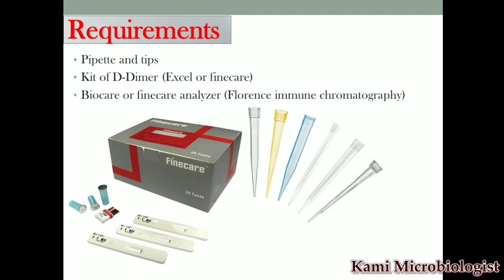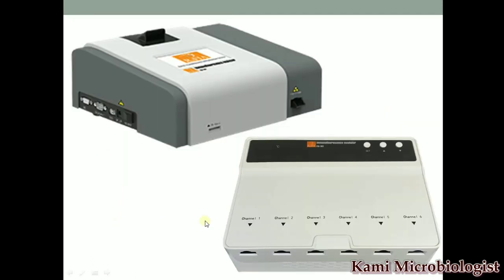Then you have to wait, meaning you will put this strip, let me show, into the channel of this incubator, which mostly comes with this machine. So you will insert it and wait for almost 15 minutes.